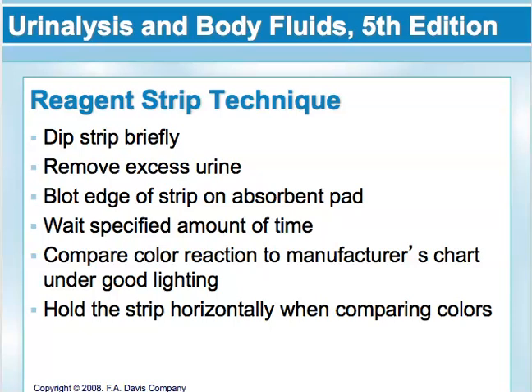Okay, techniques for using your reagent strips. You want to dip the strip briefly into a well-mixed specimen that's been allowed to come to room temperature if it has been refrigerated. You want to remove excess urine from the strip by wiping the strip along the container as the strip is removed from the specimen.